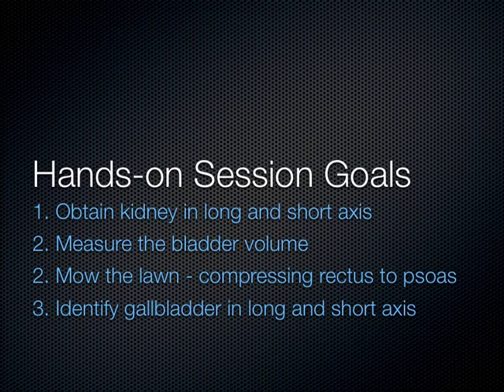You're going to mow the lawn, compress, get that rectus abdominal muscle to come all the way down, to come in contact with the psoas muscle, and then I want you to show the gallbladder's long and short axis. Any questions about this talk?